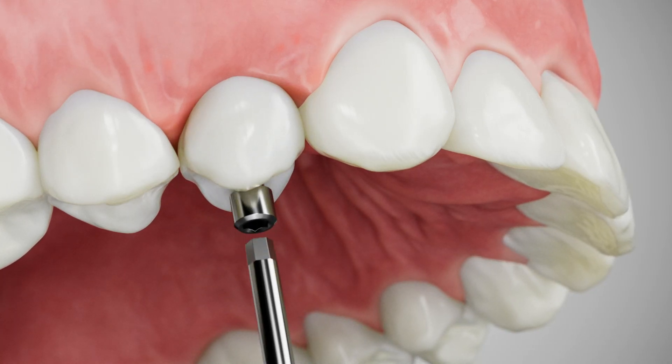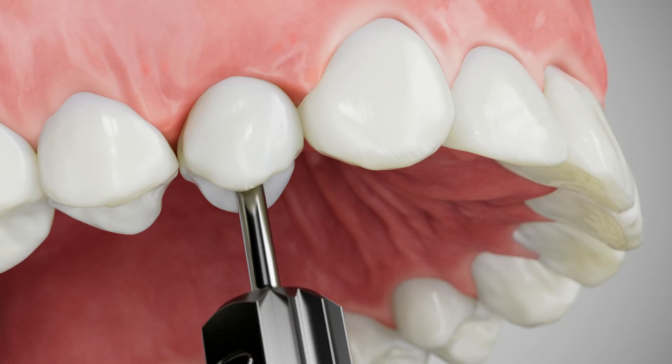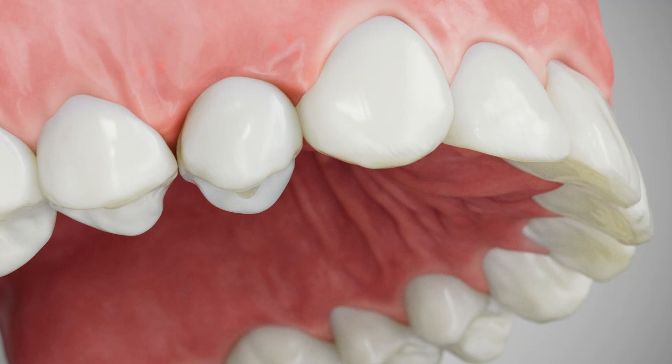Deliver the final restoration and tighten to the recommended torque value. The abutment should easily seat into the site with minimal tissue pressure, as the soft tissue profile and abutment emergence match.